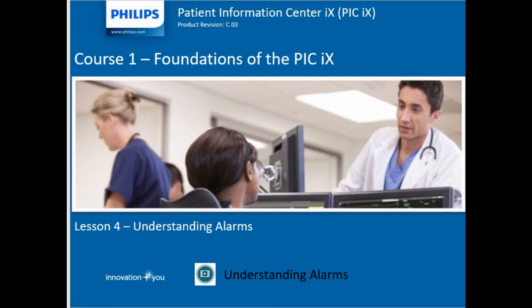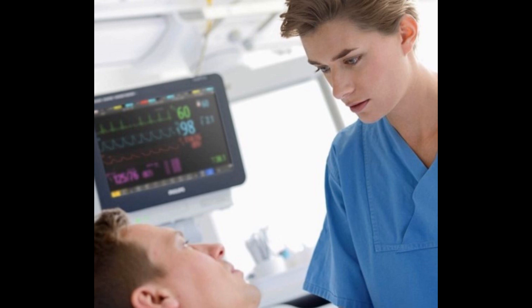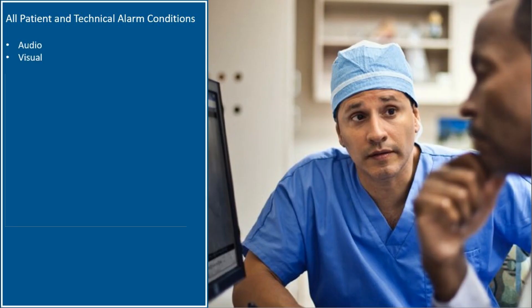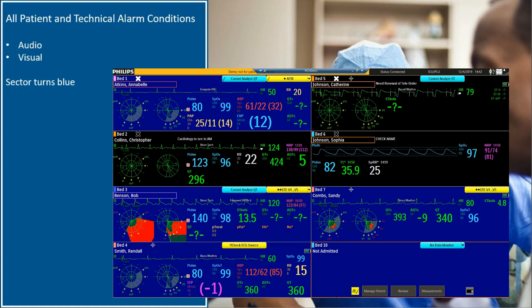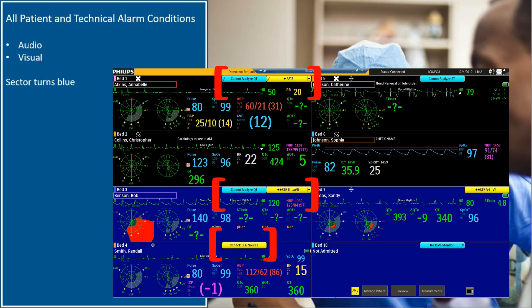Understanding Alarms. It's important that we understand the alarms that are produced at the Information Center IX. The PIC-IX provides audio and visual notification of all patient and technical alarm conditions. When an alarm occurs, the sector of the patient that issued the alarm turns blue so that you can easily identify which patient is in an alarming state. An alarm message appears at the top of the sector with information regarding the alarm type.